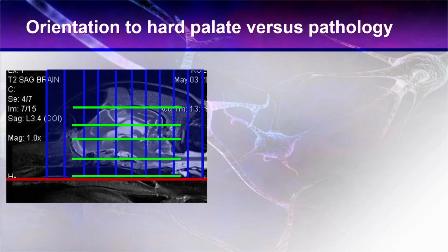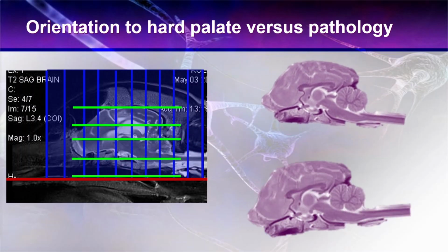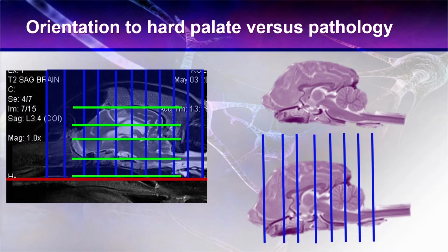But if this dog was having a post-mortem, brain out here for a post-mortem, then it's orientated, it's tipped, because when you make the slices for a post-mortem, you're not doing it at this angle. And so the slices for a post-mortem that form the basis of the anatomy images and all of our anatomy books are actually the other way round, at slightly different angles. So it can sometimes be quite difficult to work out. So making the argument that we understand the anatomy better isn't a great one, really.